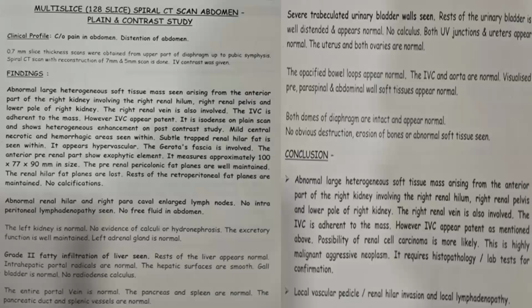Mahendra bhai, please explain them step by step. I will be very happy. Mukani, I think we are going grossly wrong here. On the CT report, they have not mentioned the left upper ureteric stone. We should not forget that the patient has an obstructing stone on the left side. In presence of obstruction, your DTPA renogram is not going to help you.